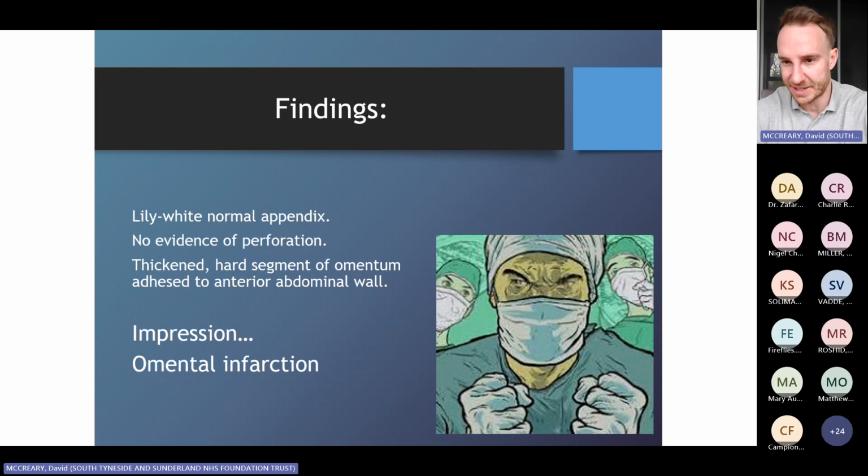And then someone's asking in the chat, is there a minimum age of the patient where we can suspect appendicitis? Remotely, I remember that 2 is unlikely. So I've definitely had a couple of 2-year-olds with appendicitis. One of them was that horrible perforation I talked to you about. She looked quite well, but her bloods were through the roof and her POCUS was crazy. I don't know if I've ever seen it in a 1-year-old.